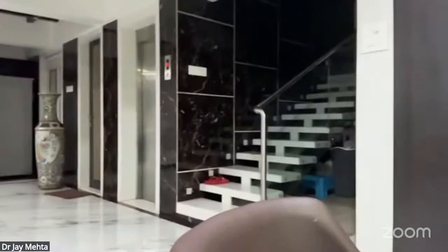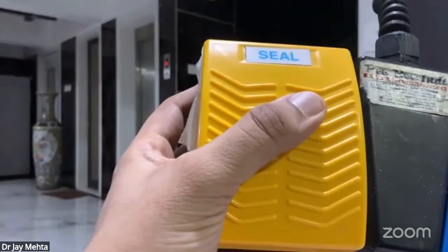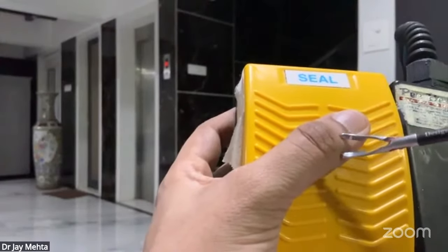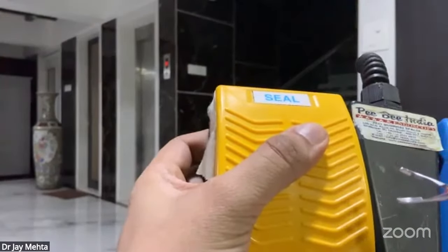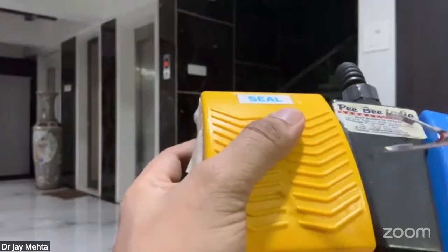Many people ask, okay, when we are using this, how are we ideally supposed to use it in our routine life situations? So if you look at the camera here, I'm just trying to get the pedal here. See, this is the foot pedal. Just before it comes into contact with the tissue and just before it grasps, that is when you press onto the seal. You can hear the cautery. I'm not holding any tissue because the only tissue currently available is my finger and I can't burn it off. But that is the principle of using this particular current.